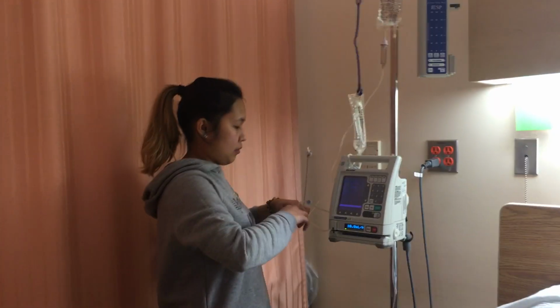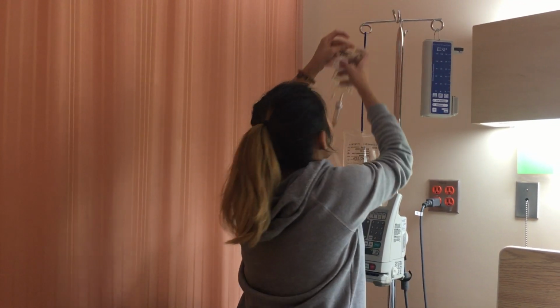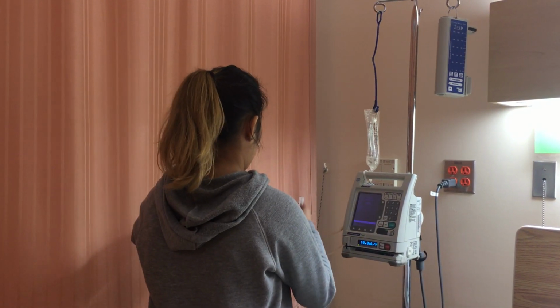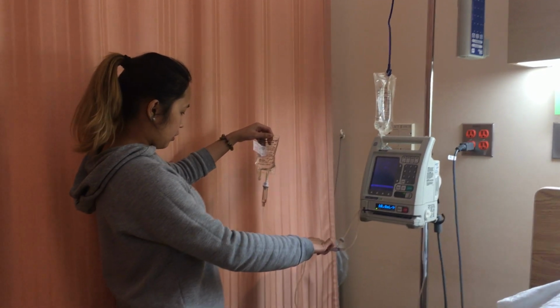And like if you did, it wasn't just going to back prime. We have more. Yeah, I think we signed up for 2 things. Okay. So I'm just gonna.